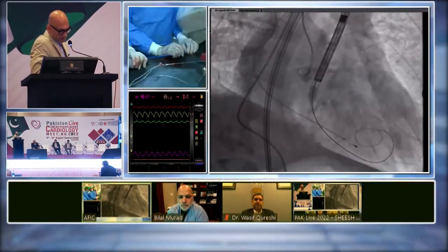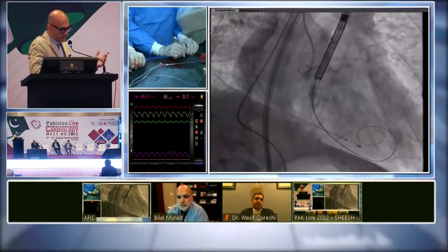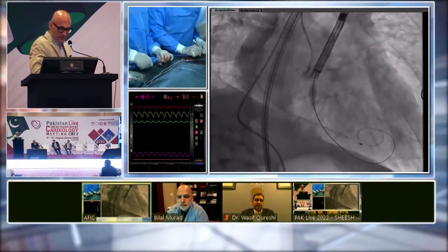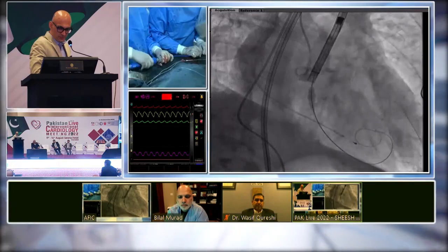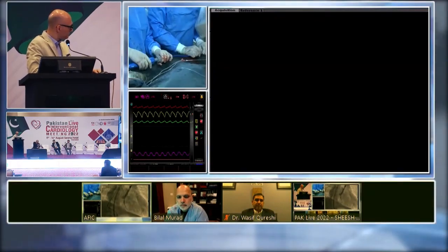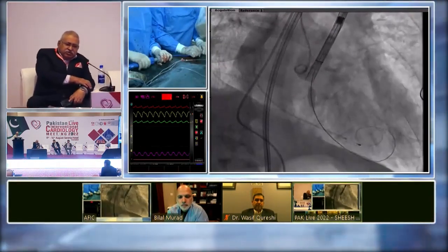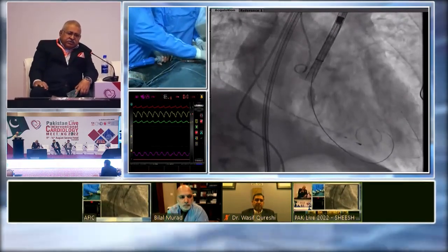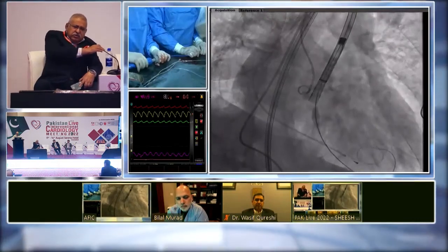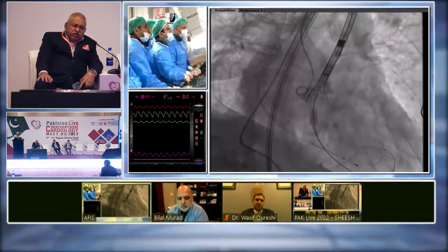So I'd like to get thoughts from Dr. Tahir Sagir. We used to do these with the 3-cusp view. Now we're using the cusp overlap view for Evolut. What do you think about the valve position and the coaxiality right now? I think the pigtail is a little bit pushed, and in this cusp overlap, yeah. Okay, but the position is okay.